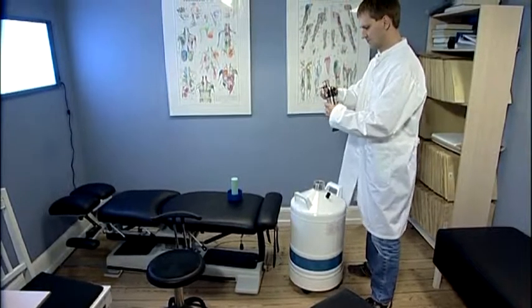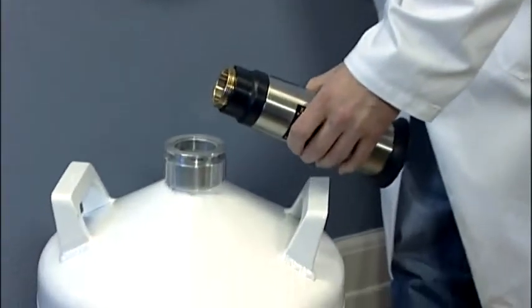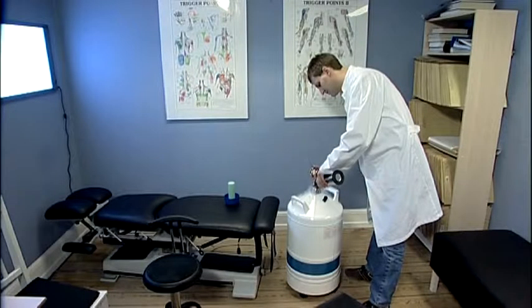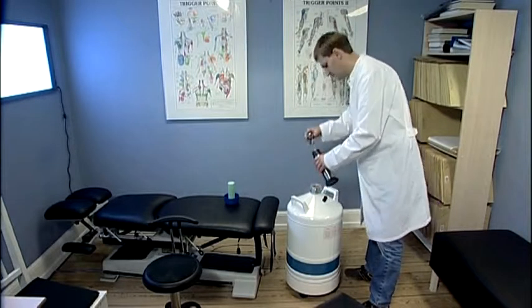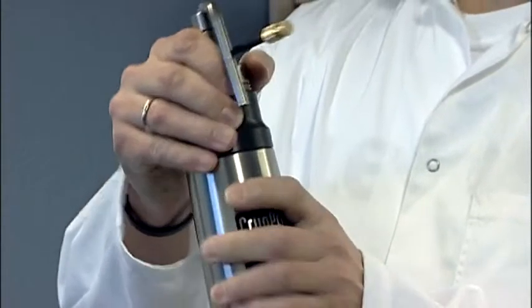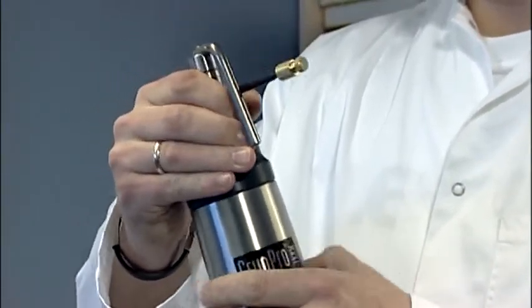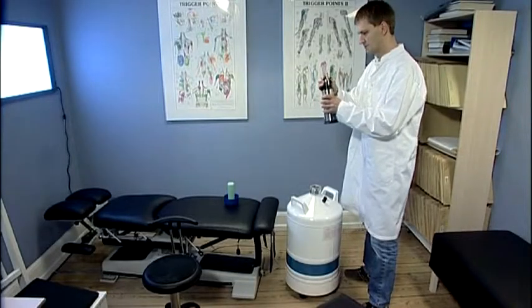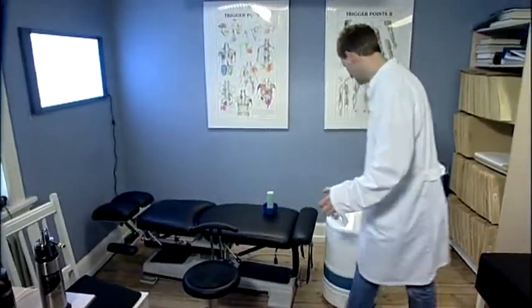Liquid nitrogen remaining in the CryoPro unit after a day of work may just be left in the unit. It will evaporate by itself. Alternatively, it may also be poured back into the container. If so, the top should be put back in place. Otherwise, condensing air from the environment will form ice crystals in the treatment unit and eventually lead to clogging of the main valve. A full container is heavy and should be handled carefully to prevent spillage.